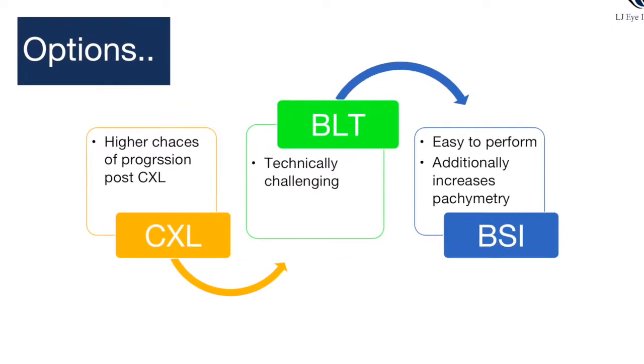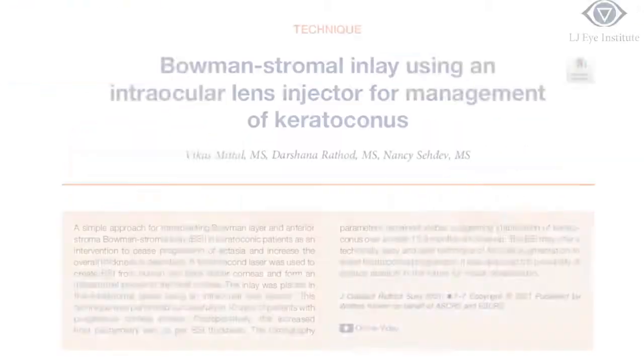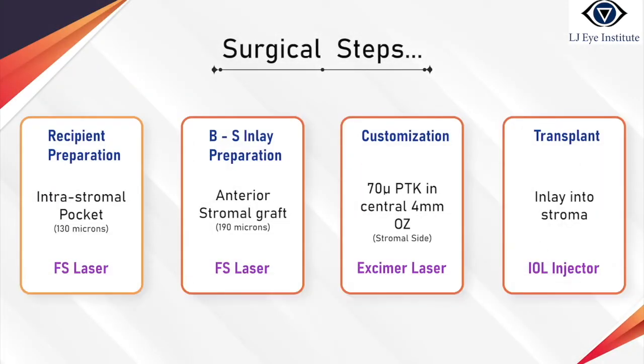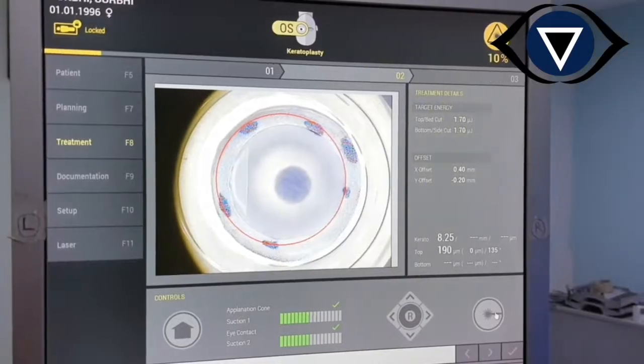The other option is BSI, which is the Bowman-Stromal inlay. We have previously published a technique where the Bowman's layer is injected in the stromal pocket of the recipient along with anterior stroma. The epithelium of the donor cornea is removed, after which the femtosecond laser is fired and an inlay is harvested, which includes the Bowman's layer and the anterior stroma of the donor cornea, which is then injected in the stromal pocket which is created in the recipient by the femtosecond laser.